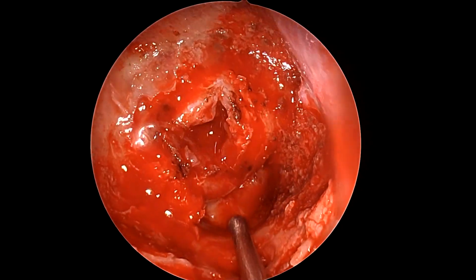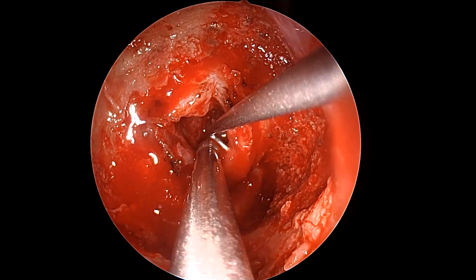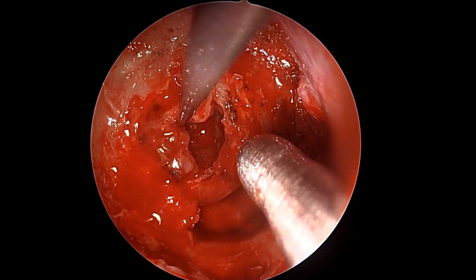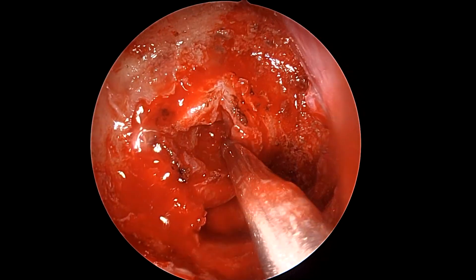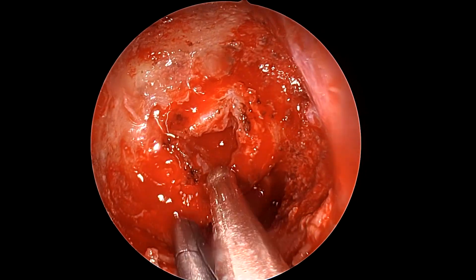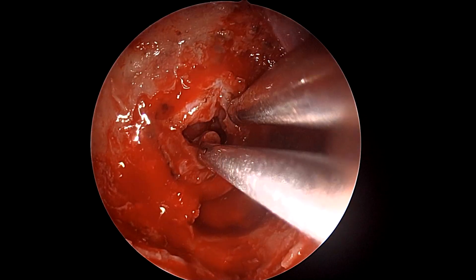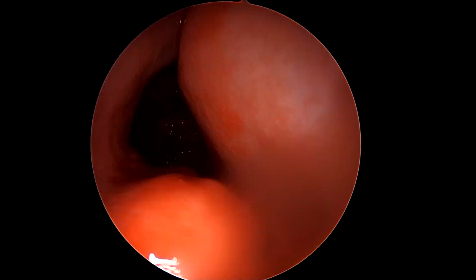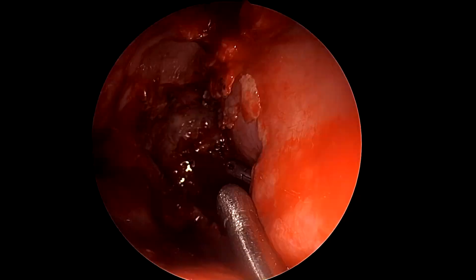It's controlled. And like I said, the controlling of a suction and the right kind of suction is very, very important in this step. And one must not ignore it, or hasten the surgery by using a large suction without any thought process. And that could significantly injure by pulling the entire tumor down as well as pulling the diaphragma sellae down by the suction force and thus causing a CSF leak.